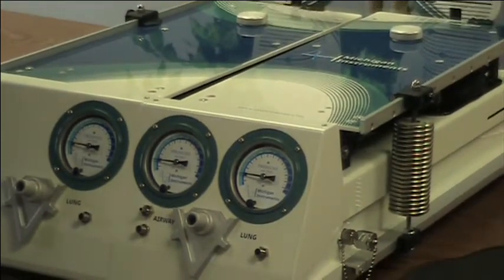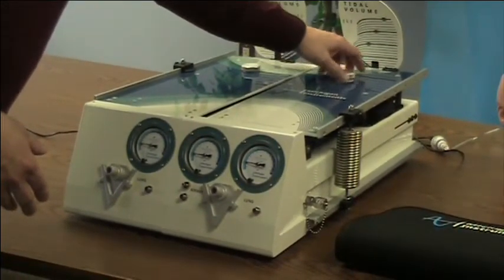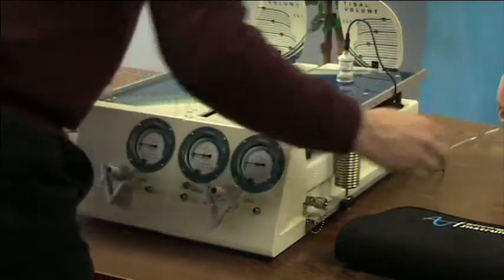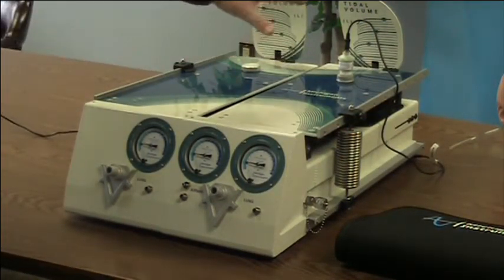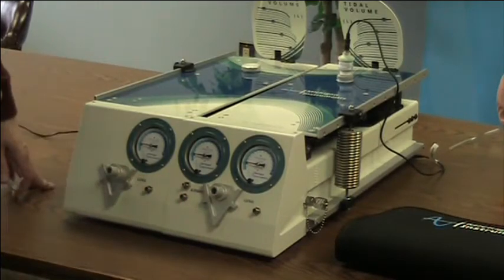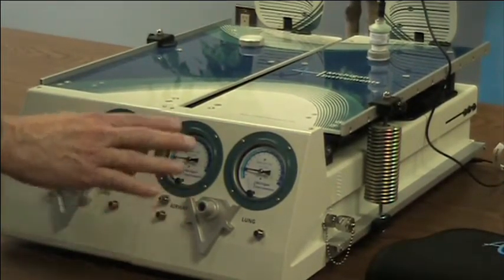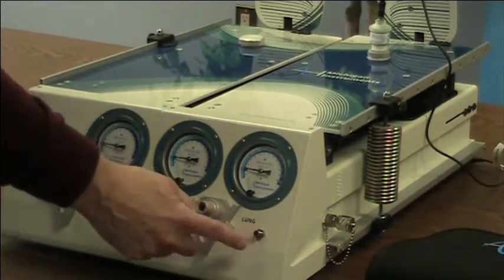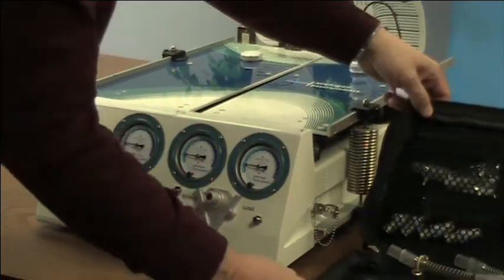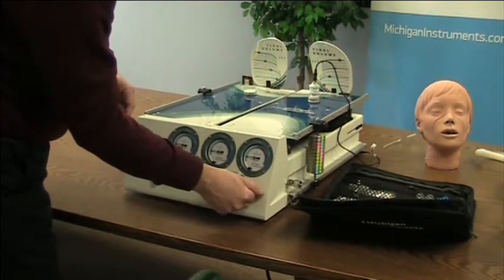A couple other features of the TTL are the oxygen sensor ports. Each lung has a port designed to fit an oxygen fuel cell — it goes right in there and seals so you can monitor the oxygen concentration in the lungs. Another feature are the auxiliary pressure pickoff ports. These are check valves, and you can use those to hook up an additional monitor and measure that pressure. You can also use those to introduce a gas into the lungs. The accessory kit comes with all the things you need for assembling an airway, including quick connections for making use of those auxiliary pressure ports.